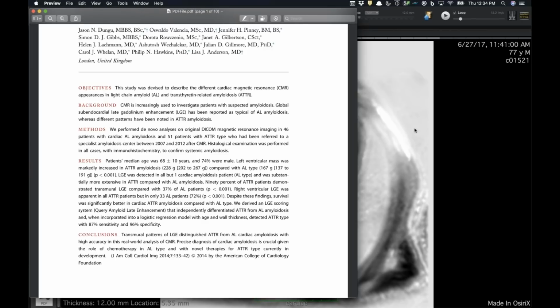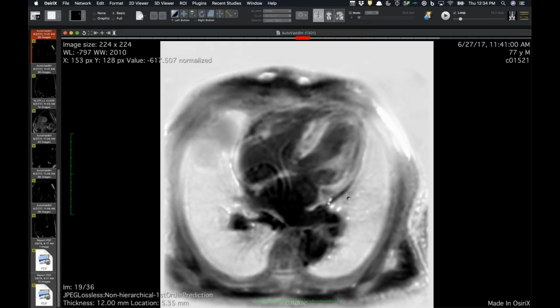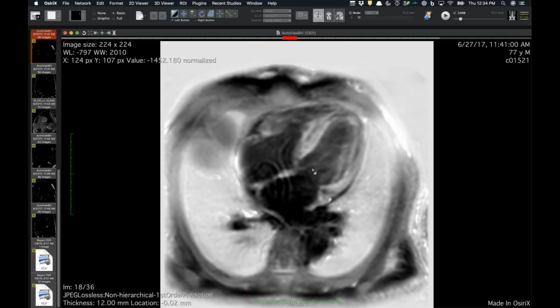I don't know, Seth, are you still on there? Do you use this reliably as a distinction? I call that the zebra stripe pattern.